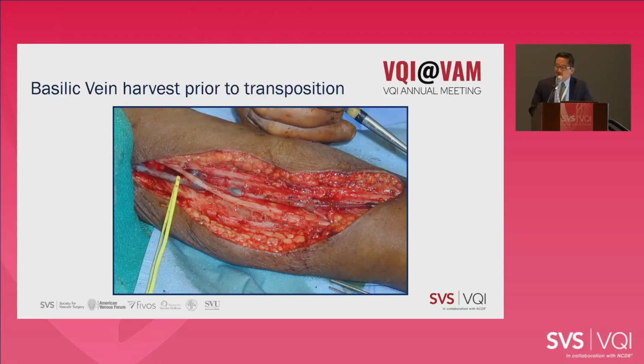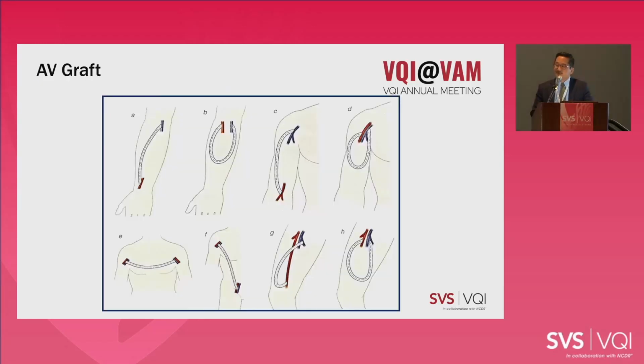This is an intraoperative photo of what that may look like. It's a very large incision, which can be a little bit cosmetically disfiguring, but if it leads to a good access, then many times it's considered acceptable. Again, this second stage is considered a follow-up to the initial surgery and is not captured by itself.